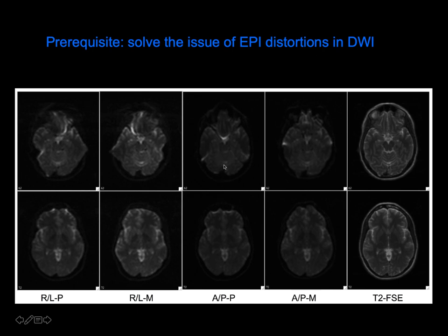And typically, what is done that is less disturbing to the eye, but is still a significant distortion being present, if you acquire with a phase encoding direction anterior-posterior, you have this type of distortion. But you can see that they are less disturbing to the eye because they respect the symmetry of the brain, but still you have, look at the temporal lobe, the signal can be piled up down here with the negative blips and piled up there with positive blip.